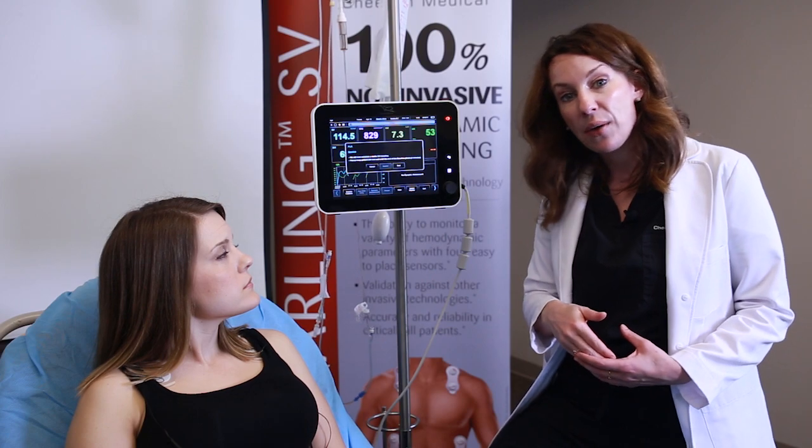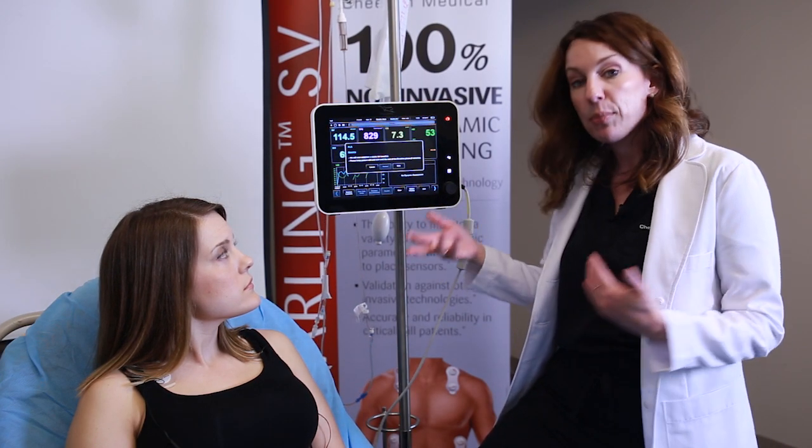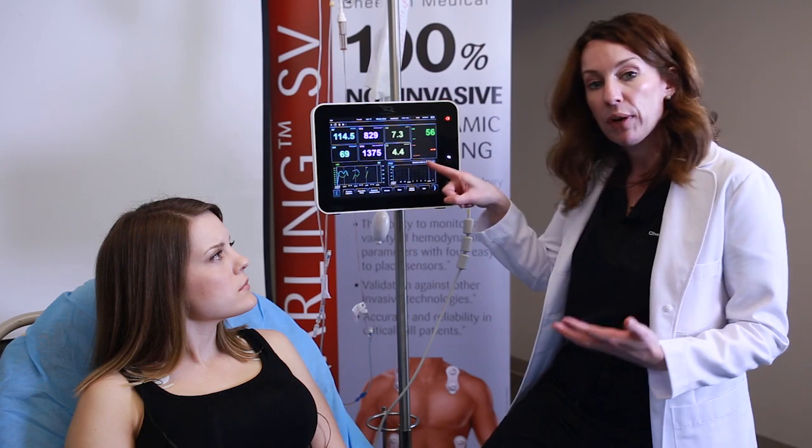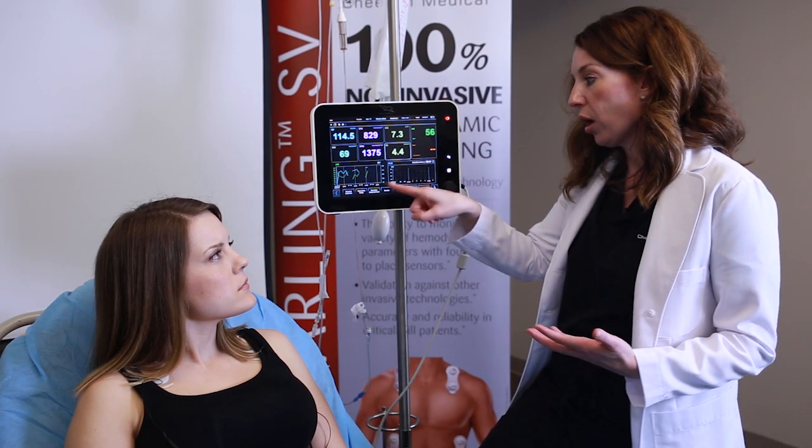PLR baseline, we will now establish a stable SVI baseline. Please keep your patient still and wait until the end of the baseline phase, which is 3 minutes. We're going to go ahead and hit next. So it's just warning you that we have a 3-minute baseline, right? The baseline stage lasts for 3 minutes. There's a baseline timer right here in our protocol box, and it will count down for you. The patient should be semi-recumbent for this whole 3 minutes, all right? So we're going to keep them still, no talking.